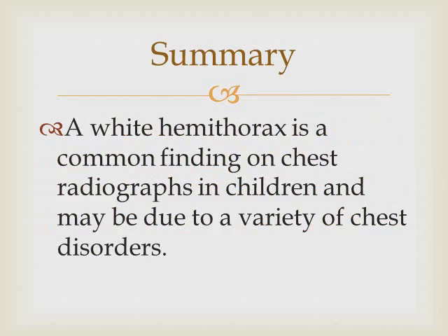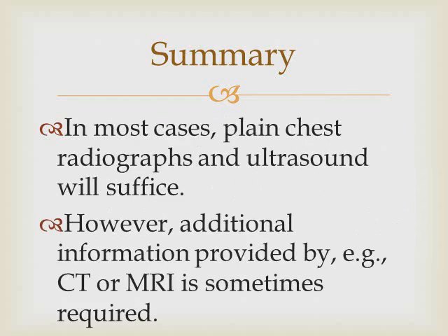So, in summary, the white hemithorax is a common finding on chest radiographs in children and it may be due to a variety of chest disorders. In most cases, plain chest X-ray and ultrasound are enough. However, additional information provided by CT or MRI is sometimes required.